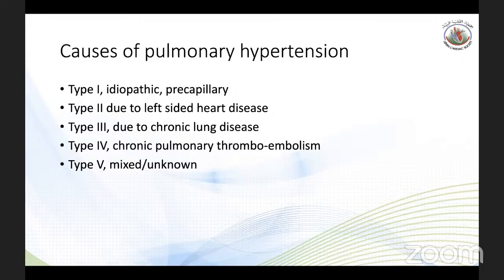The other thing worth mentioning is that when you wedge and you got the right wedging, and you're doing your left ventricular end-diastolic pressure, the difference between the left ventricular end-diastolic pressure and the wedge pressure should be 5 or less. If it is more than 5, then there is a mistake in the wedge, and you probably have to repeat that again.